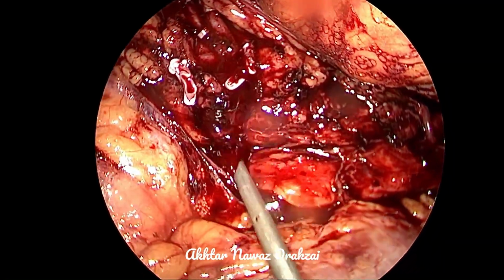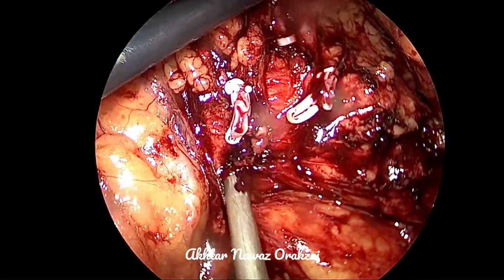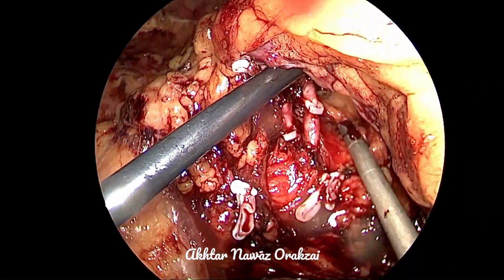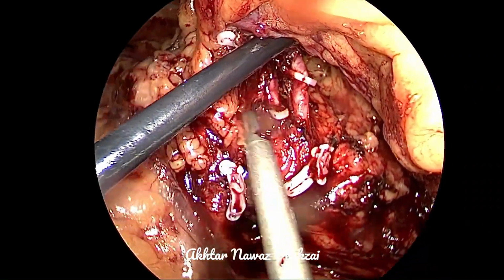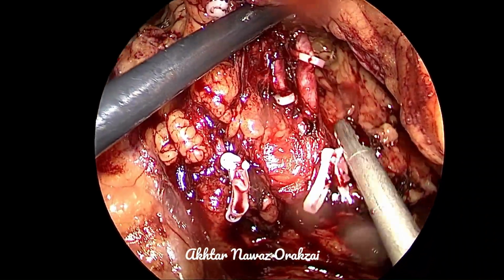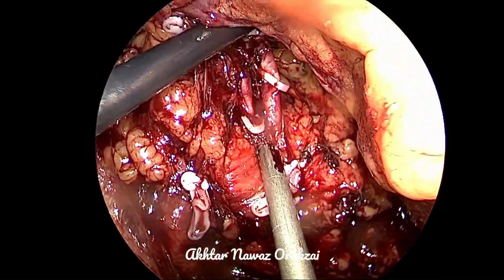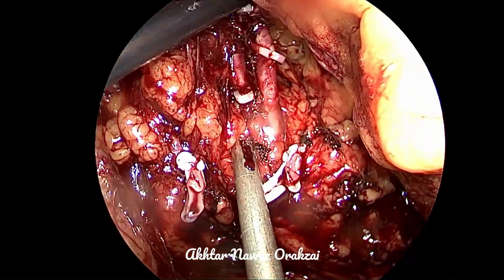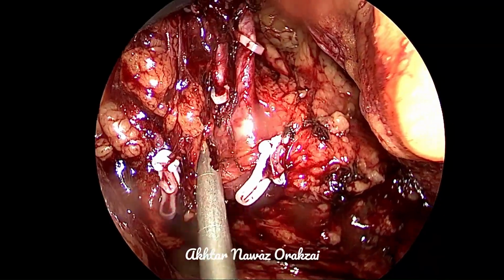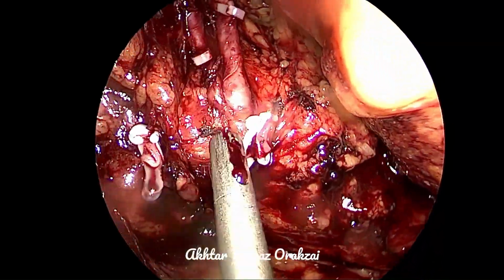A little bit of cleaning is required because some small vessel bled at the time of application of the right angle. There is no significant bleeder. The field is quite clean now. So we dissect proximal to those two arteries that we clipped, and we found that our supposition was correct.